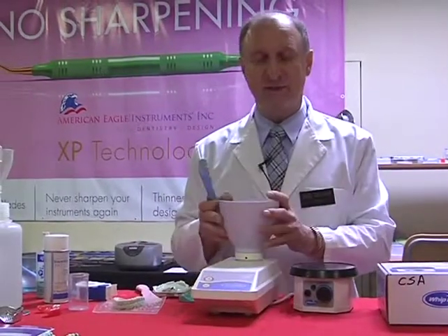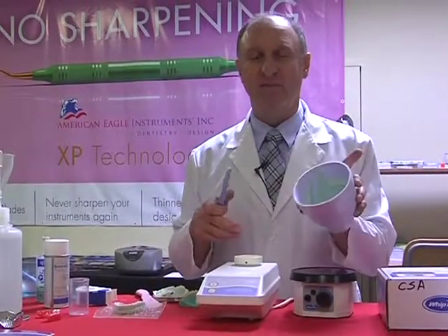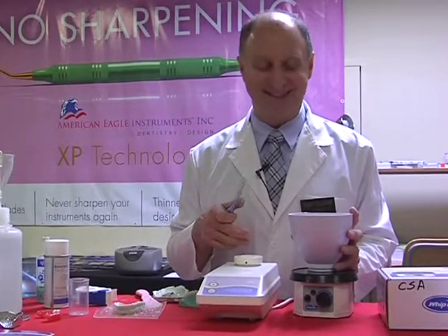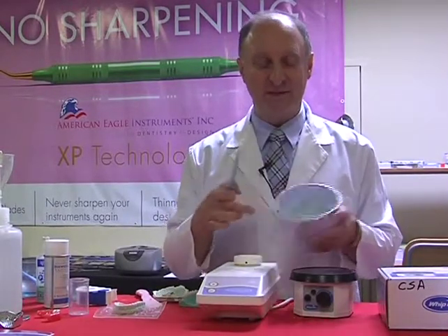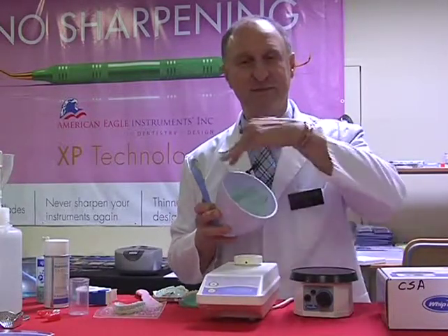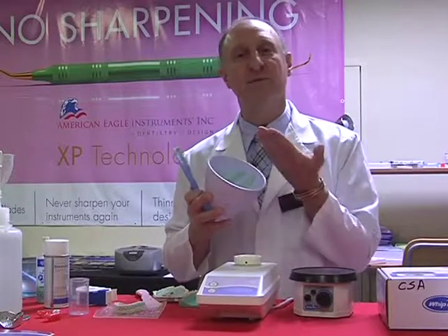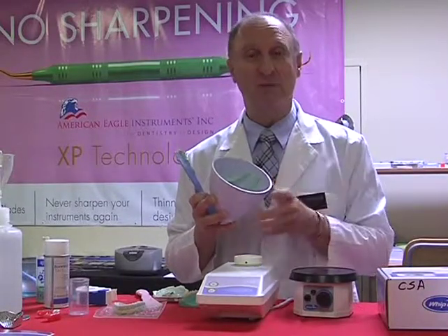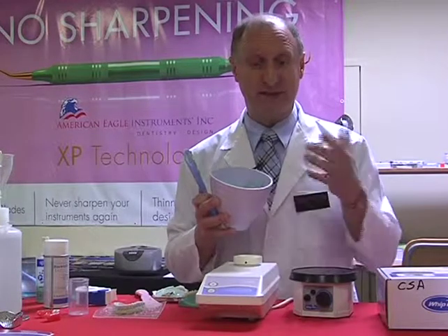One of the worst things that you can do is taking your bowl with a mix on top of the vibrator, and I see every office doing this. They watch all the little bubbles come from the surface, but what it's going to do is actually take more air from around the surface of the bowl, put it back through the mix, and so you're actually aerating the mix, which is really what we don't want to do. We want to try and squeeze all the air out.